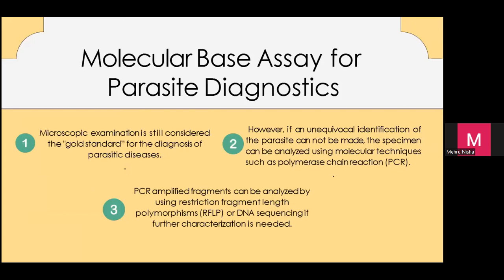Okay. Molecular based assay ni memang is very good, memang like rapid, effective, sensitive, specific. Okay. Tapi in bidang parasitology, microscopy examination is still considered the golden standard method for diagnostic of parasite disease.